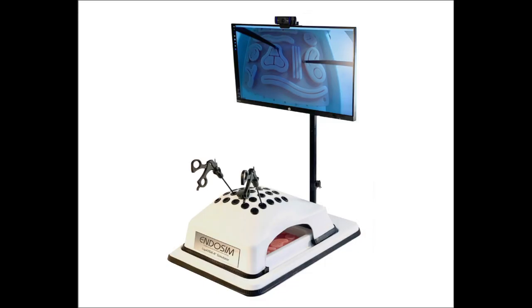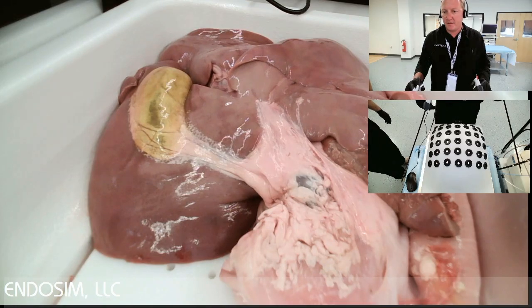This video demonstrates the new Lab EZR Simulator from the company Endosim. Hi, I'm Dr. Kai Mathis. I'm the founder and owner of the company Endosim, and I'm presenting here our Lab EZR Simulator.